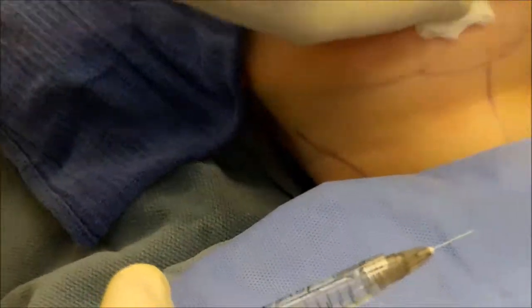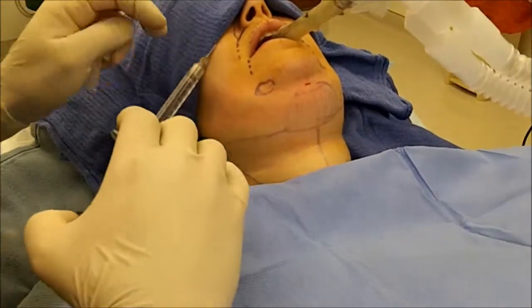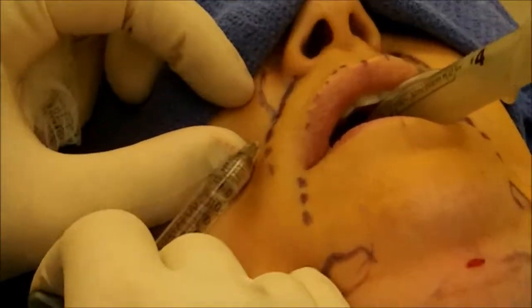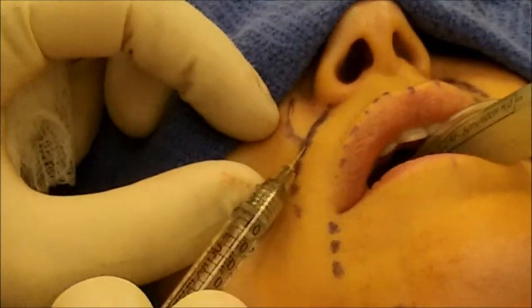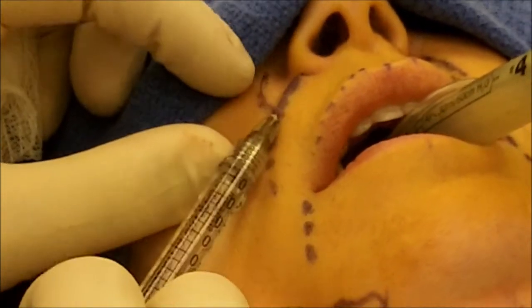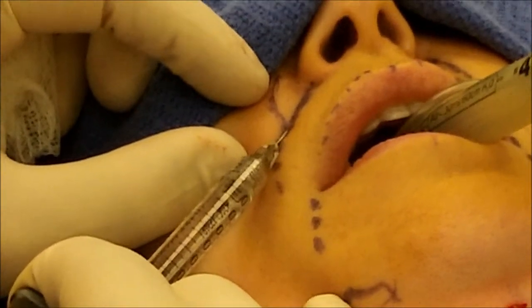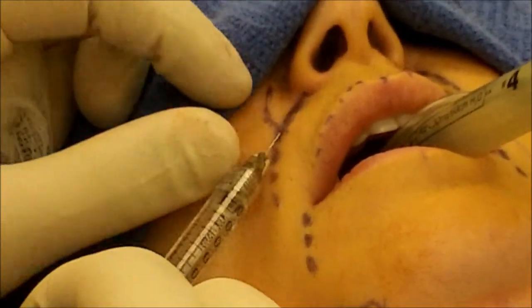This patient is asleep, but we also do it awake on most patients — she happens to be doing it while she's sleeping. The injection technique is to place the needle right into the skin in one location, just below the dermis, deep to the dermis, and carefully fill the areas with very small amounts as I'm pulling out.